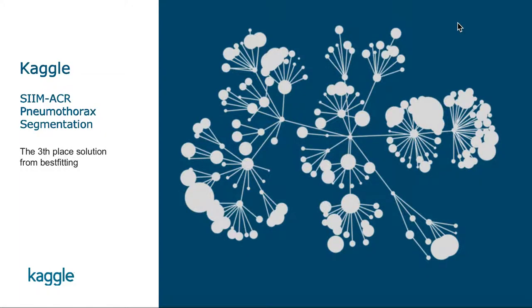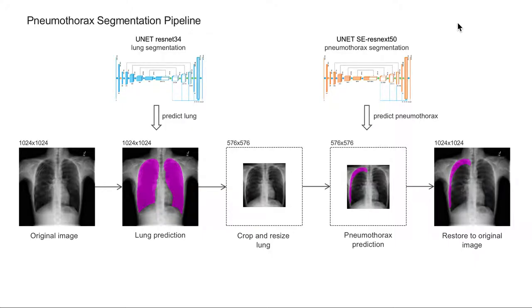Hi, I'm bestfitting. In this video, I will introduce my third-place solution to the SIIM-ACR competition. This is the pipeline of my solution.